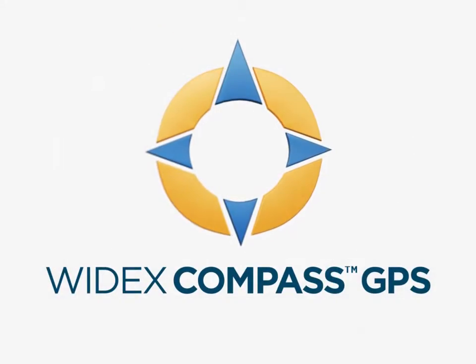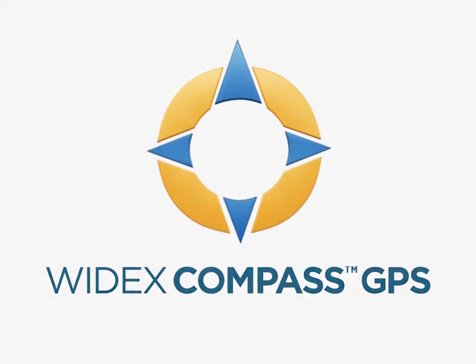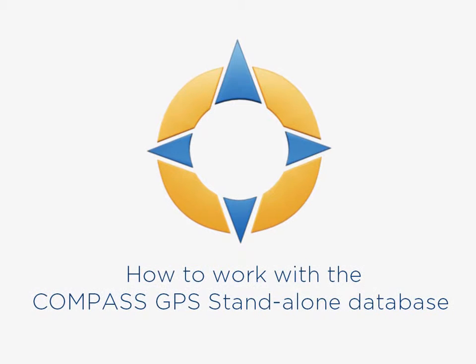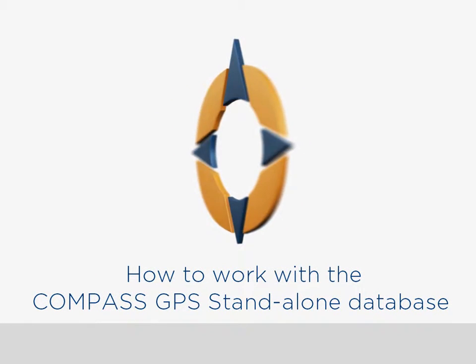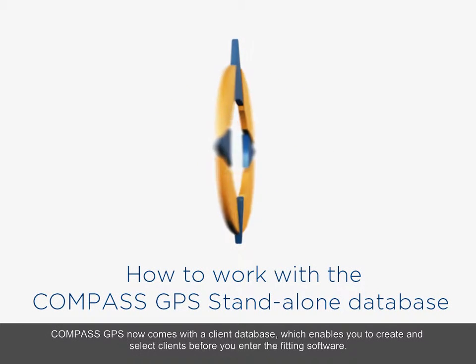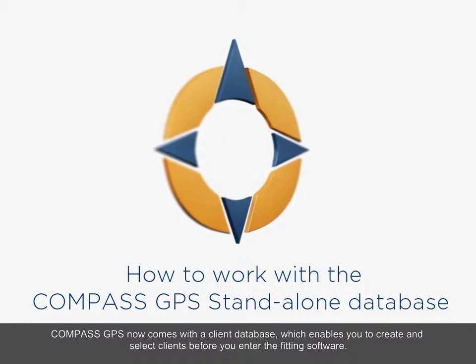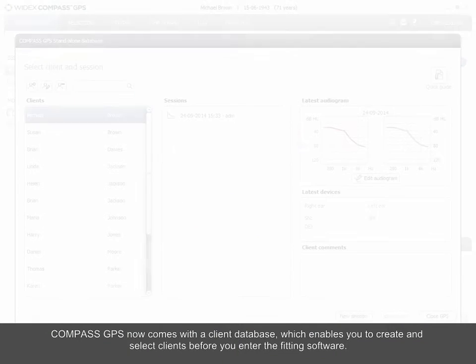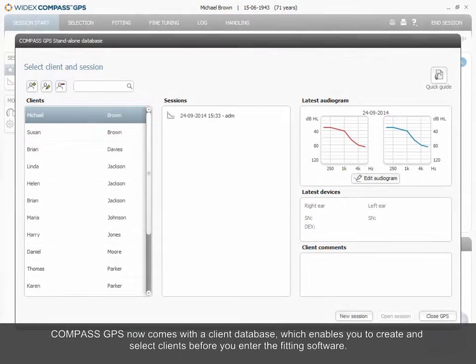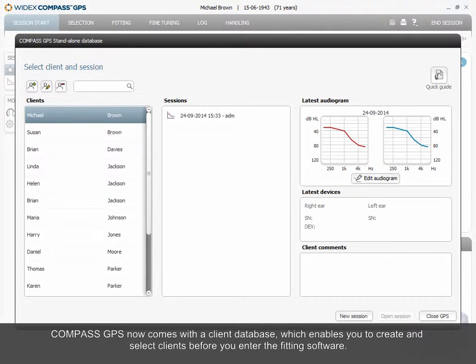Welcome to this e-learning tutorial on working with the Compass GPS Standalone Database. Compass GPS now comes with a client database which enables you to create and select clients before you enter the fitting software.